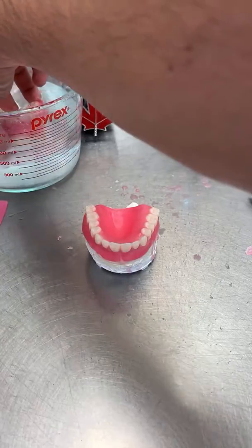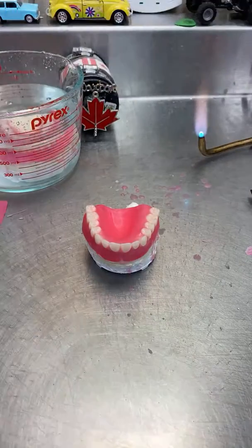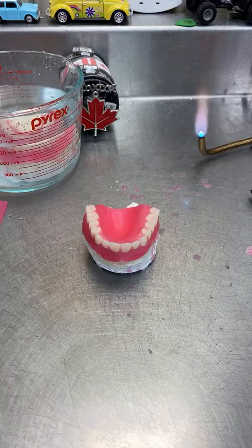So I'm just gonna soak it in water here so it can be removed easily from the cast.